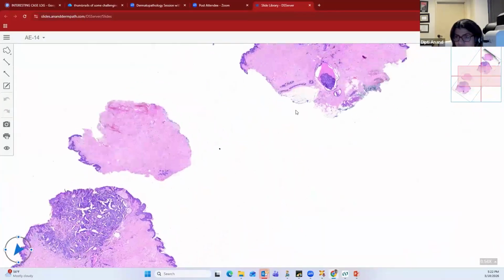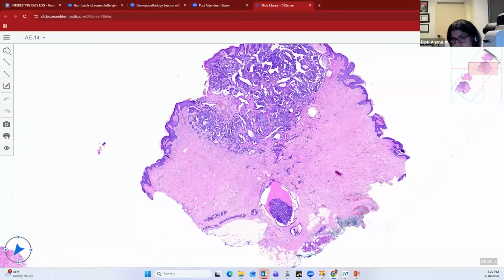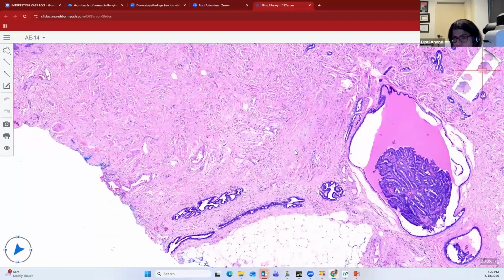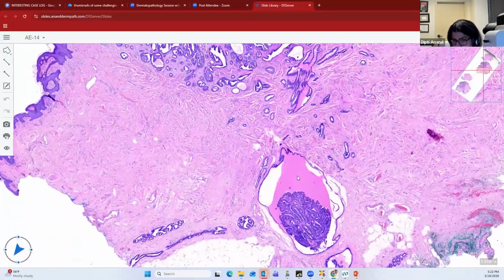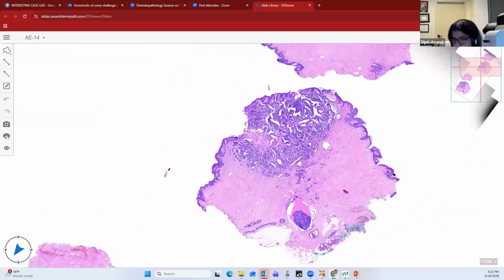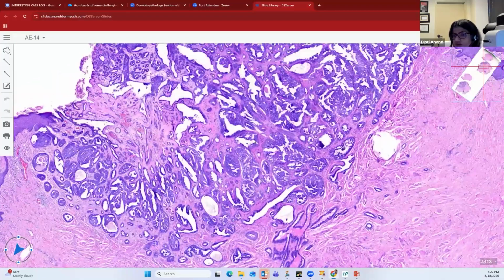And these are intraductal papillomas. So they arise from the nipple duct. You can see at the periphery of the lesion, this is the nice nipple duct, which is growing up into the skin, oriented perpendicular to the epidermis, and then arising within the duct is this structure, which will grow up like a flower. So that orientation would often help you to recognize a tumor. You can see that this is the ductal stem of the tumor, and then it proliferates out.